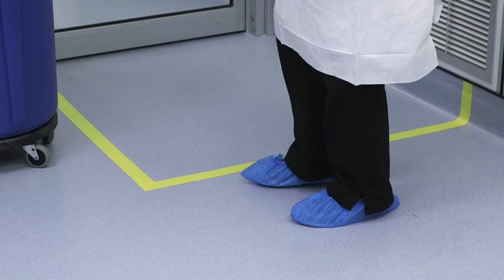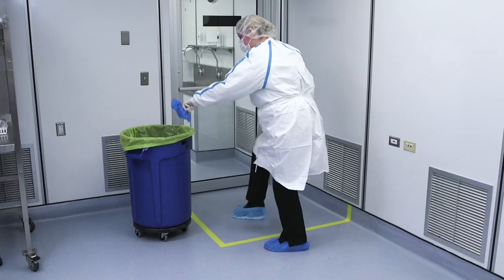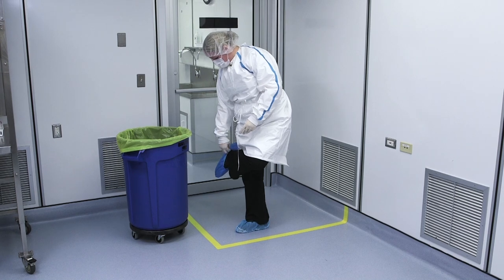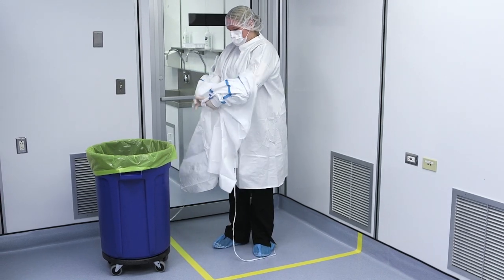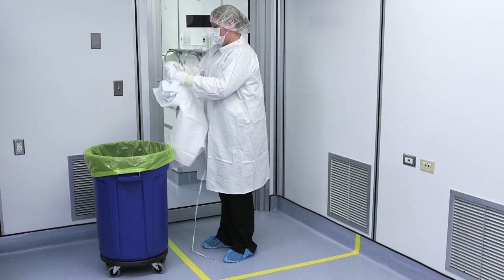After doffing the outer pair of chemo gloves inside the containment primary engineering control, the worker should proceed to the doffing line of demarcation. At this location, the worker will carefully remove the first outer shoe cover while stepping over the doffing line, followed by removing the outer shoe cover of the other foot and stepping over the doffing line again. All PPE removed is placed into trace HD waste receptacles.